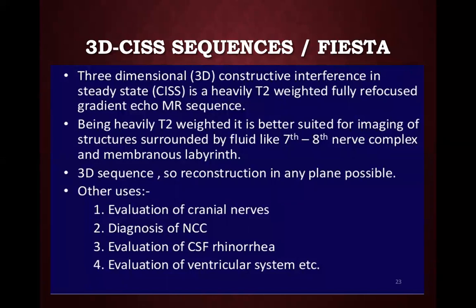What is the importance of this? What we do here is completely the inversion of what I just told you. I just told you that I'm going to completely suppress the signal coming from T2. That is, whatever signal is coming from CSF, I'm going to say nothing doing. That is FLAIR. When I say I want everything from the CSF, I love CSF and whatever is happening in the CSF, that is CISS 3D. This is completely opposite of FLAIR.